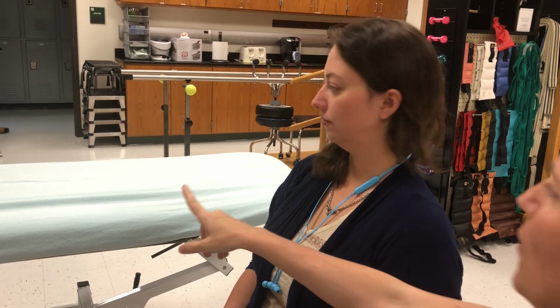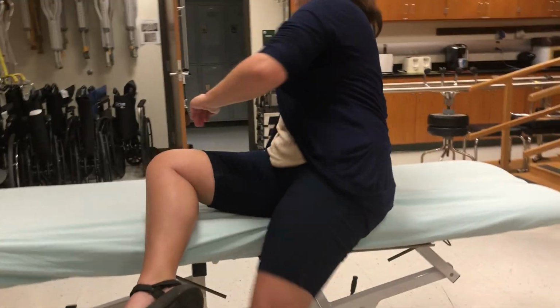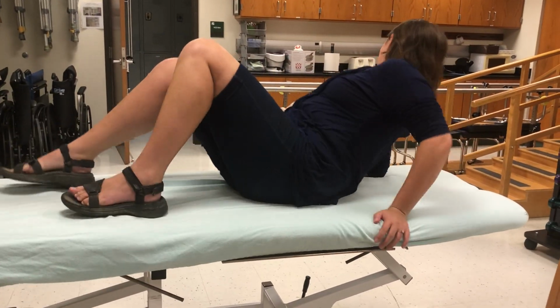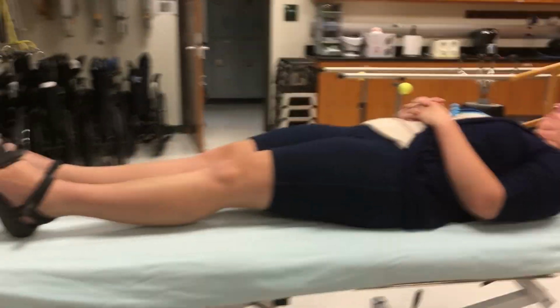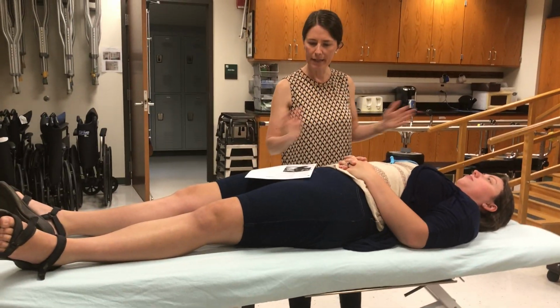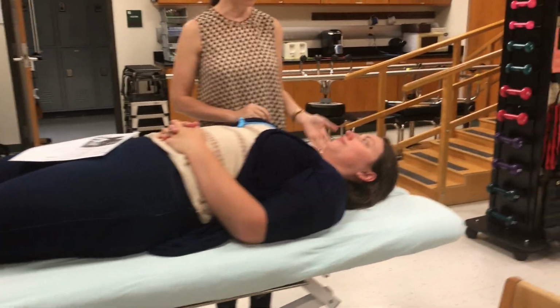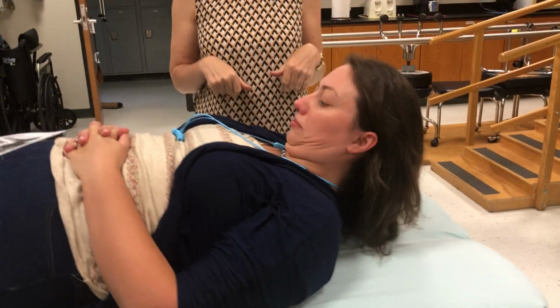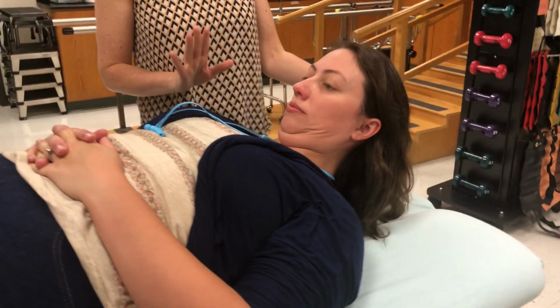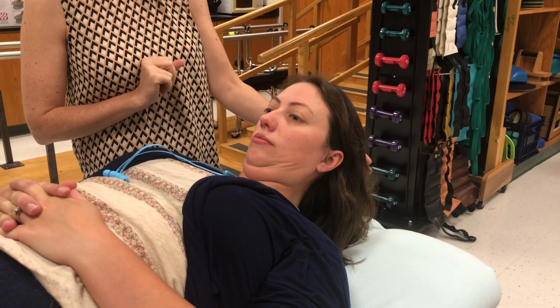Okay, and now we're gonna do MMT for cervical flexion, so I'm gonna have you lie on your back. So the standard patient position for cervical flexion is supine, and the therapist is gonna stand near the head of the bed to the side of the patient. And the cues are, I want you to lift your head up off of the table and bring your chin to your chest. And then that's at least a grade 3 right there if she went through her full available range of motion. I'm gonna try to push you back down.